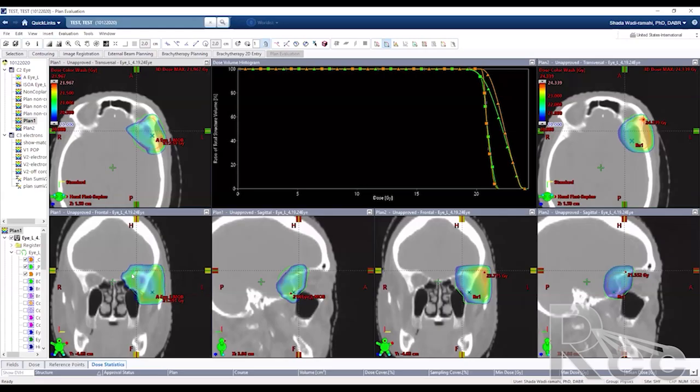So what you also want to see is the distribution of your prescription dose, and you'll not get the distribution from the DVH alone. I could be underdosing a complete strip over here, including maybe the CTV, but the DVH will tell me, oh, this is good. We still have 95% coverage, 95% of dose, right? But how is this covered?